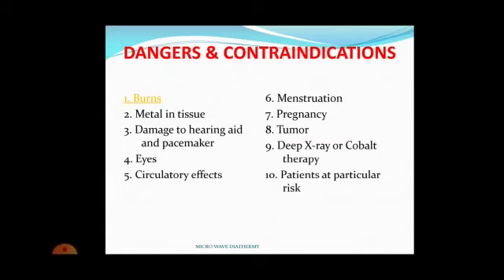We all know that whenever this heating modality is given, the patient may be getting more intensity. In microwave diathermy, the amount of intensity is decided by the patient only. As a therapist we set 200 watts, that is fine, but if the patient tells us they are feeling more heat, definitely we should reduce the intensity.